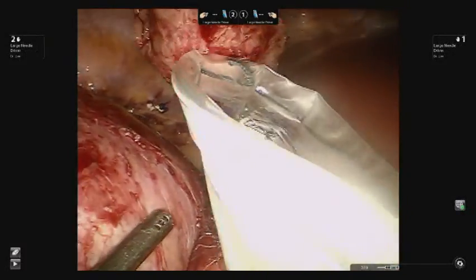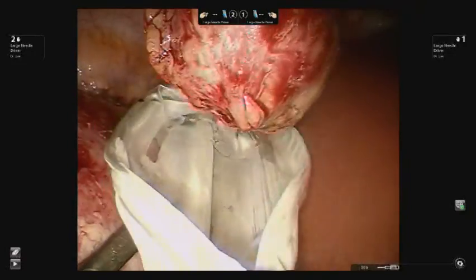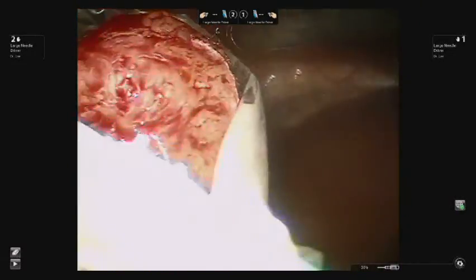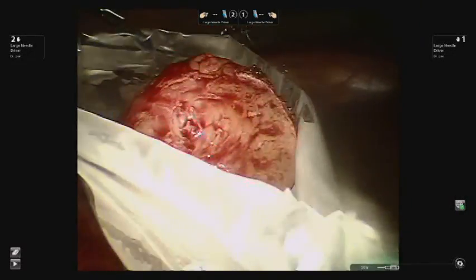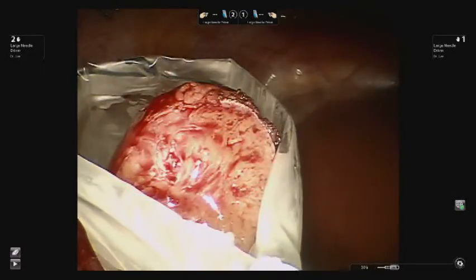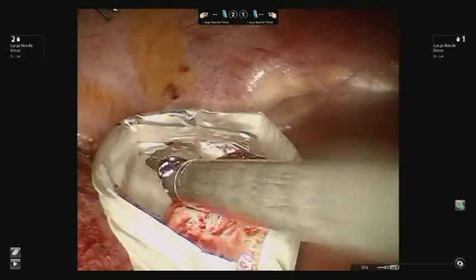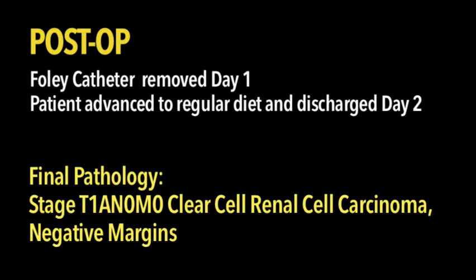The specimen is then placed into an Endocatch bag and the kidney is retroperitonealized. A drain is placed in the perinephric space at the end of the case. Postoperatively, the Foley catheter is removed on day one and the patient is advanced to a regular diet, typically discharged on postoperative day two.